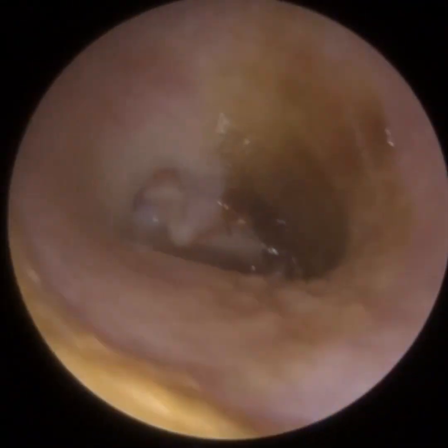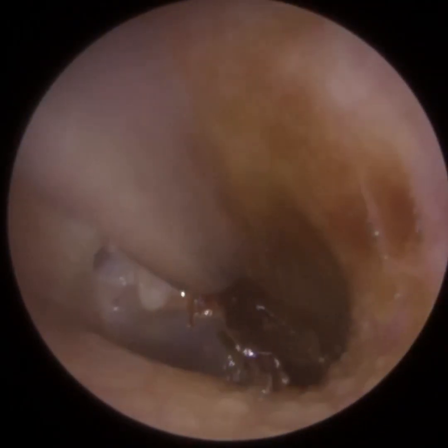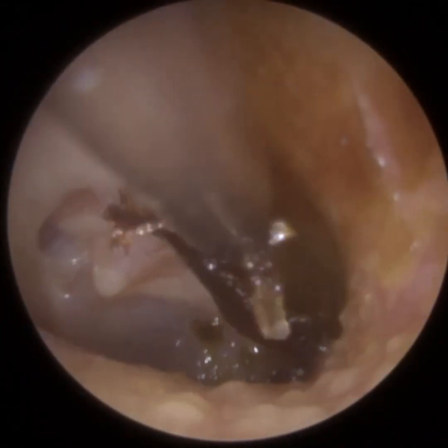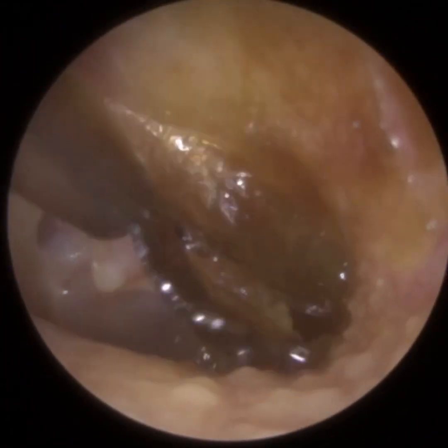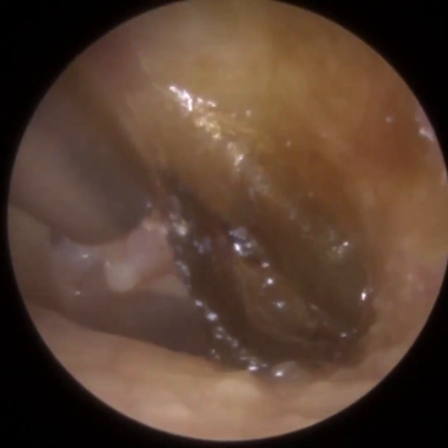Now that I've detached the skin off the eardrum, we can see the top part of the eardrum there, and he's also got an attic retraction here because of a blocked eustachian tube. So you're just going to see me peel away the rest of this dead skin delicately off the eardrum and the canal. And what I should do, I'll just answer a few questions from yesterday's video.